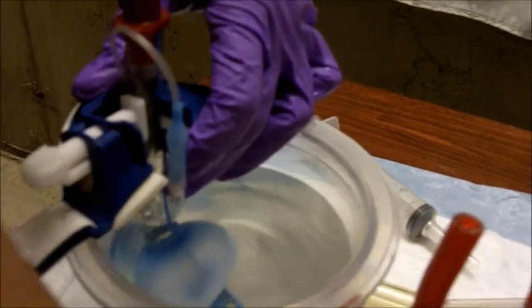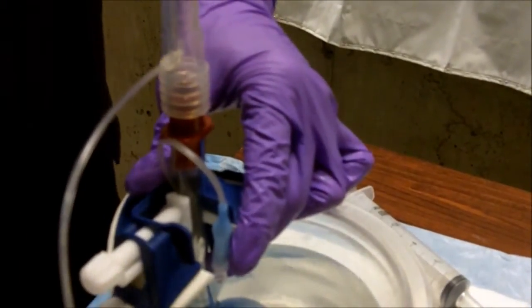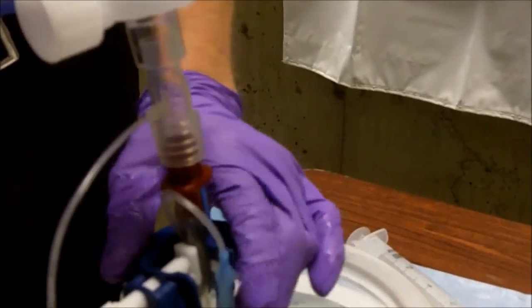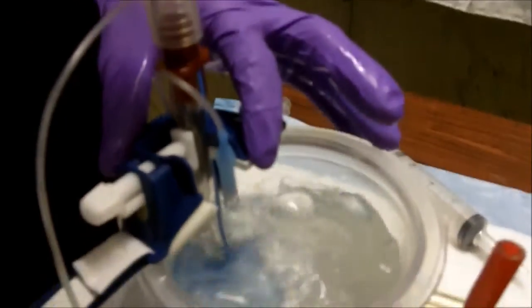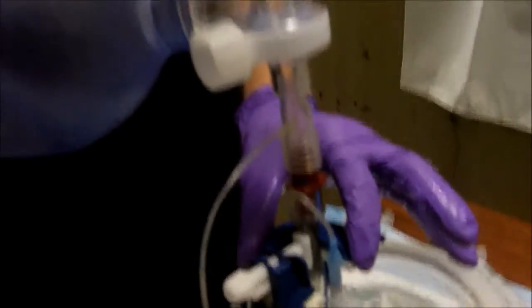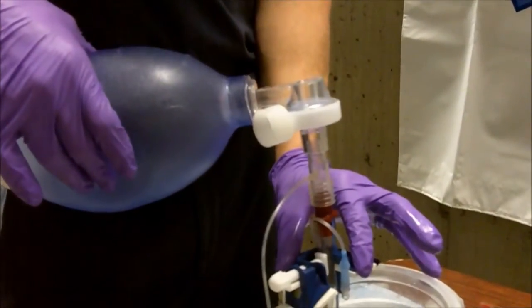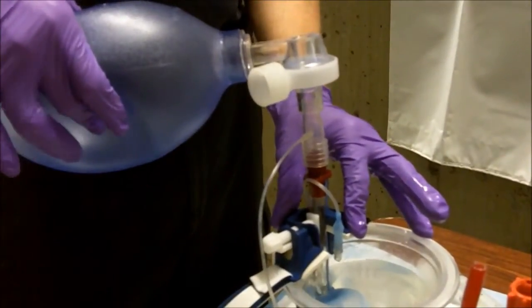And we will also include end-tidal CO2 monitoring, which is the standard of care in the state of Maine. This is our end-tidal device, which hooks up to our EKG monitor and provides us with an end-tidal rating. It also guides and directs therapy. We will then proceed with a very small volume of air. You notice how I squeeze and I'm accelerating the rate. It should be one ventilation with this device, one ventilation every six to eight seconds.